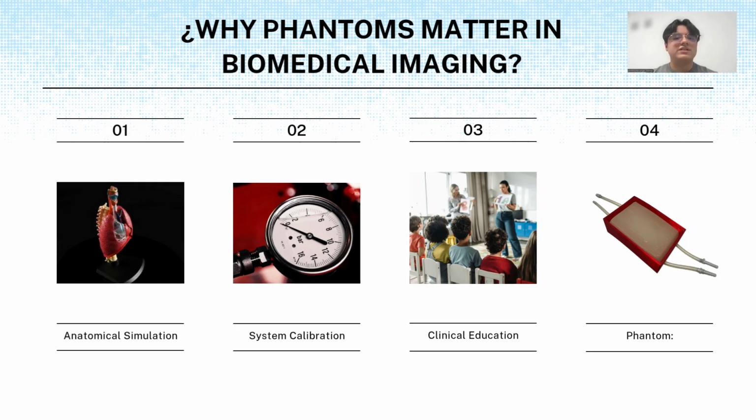Vascular disease such as stenosis is a major health concern, and Doppler ultrasound is a widely used non-invasive method to study blood flow patterns. However, interpreting these images can be challenging, especially when changes in vessel diameters or flow symmetry are subtle. Our objective was twofold: first, to construct a phantom that realistically mimics healthy and stenotic vessels, and second, to implement a machine learning model capable of classifying these conditions automatically.